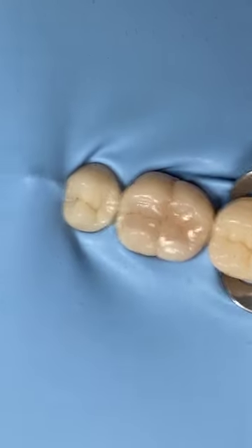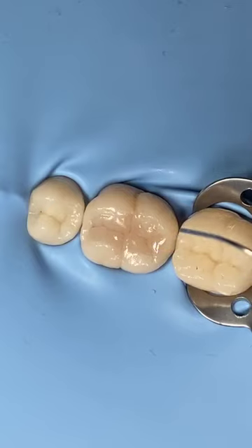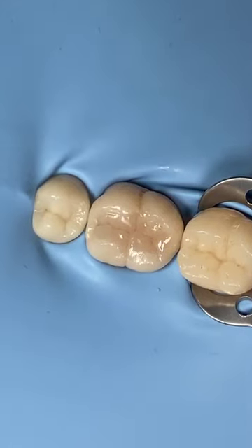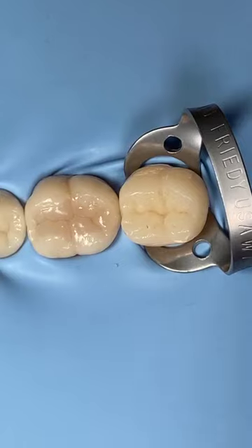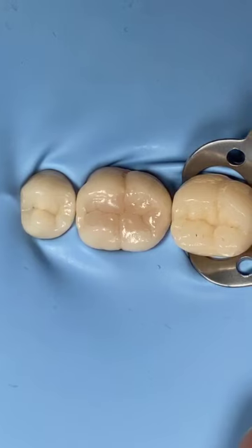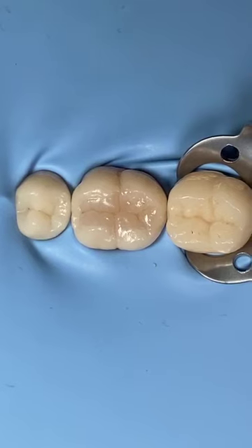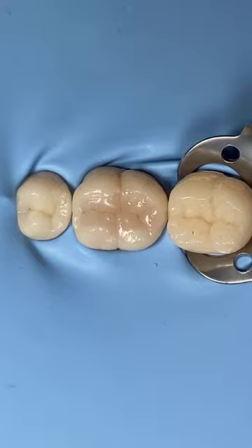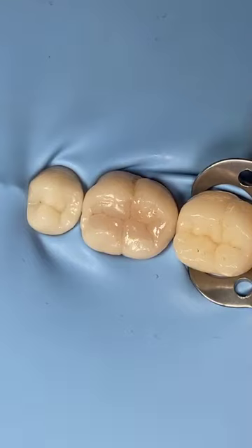If your patient requests not to have a color on the tooth, maybe you can use transparent flowable. Yeah, the transparent flowable is better, especially when your patient is a dentist maybe, or a person who is not into the natural brownish look. You can use transparent flowable. Okay, just take this low viscosity stain.